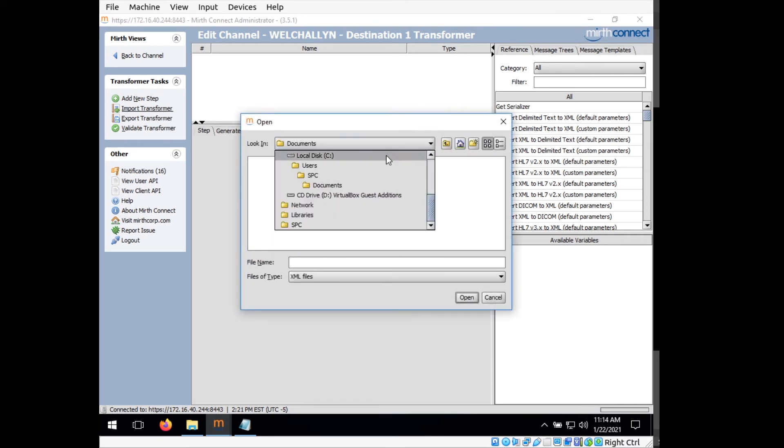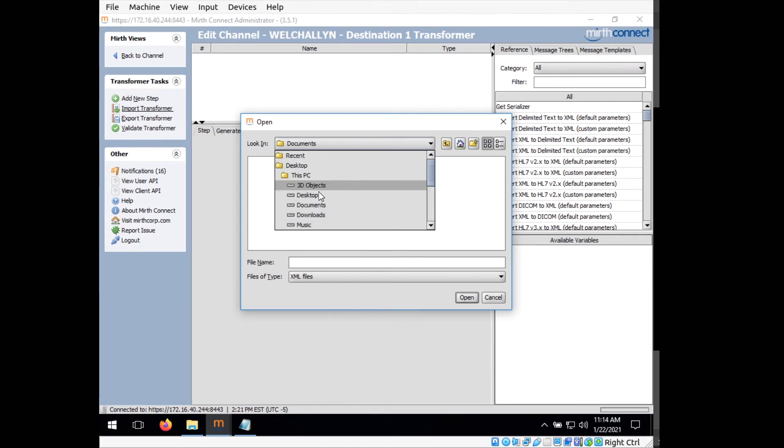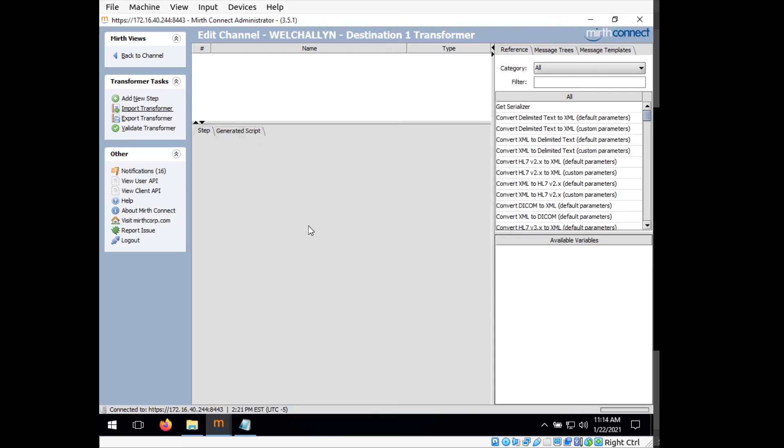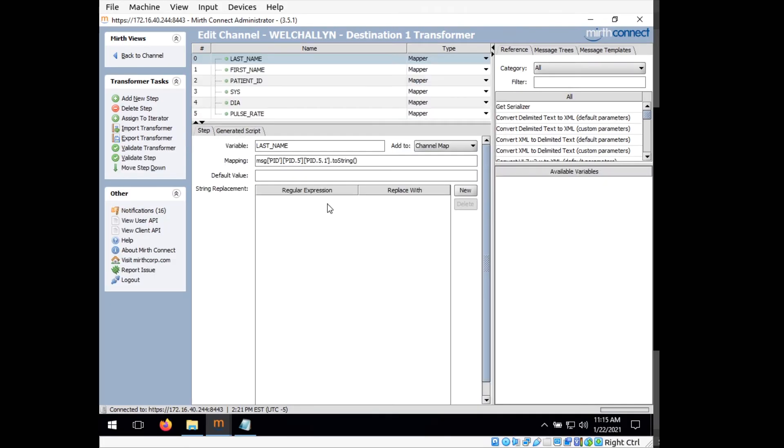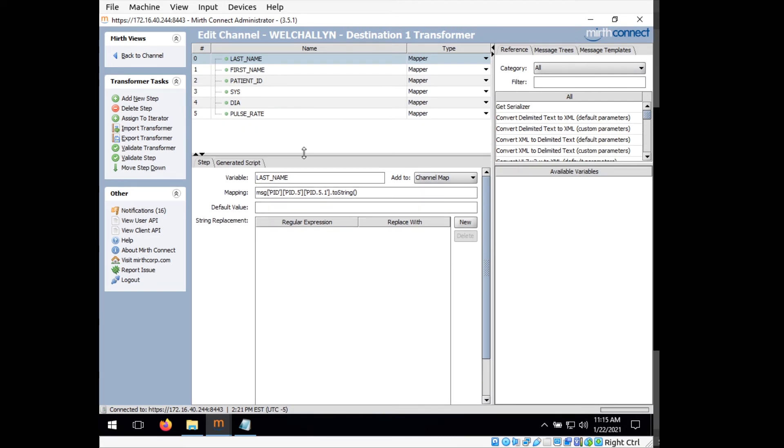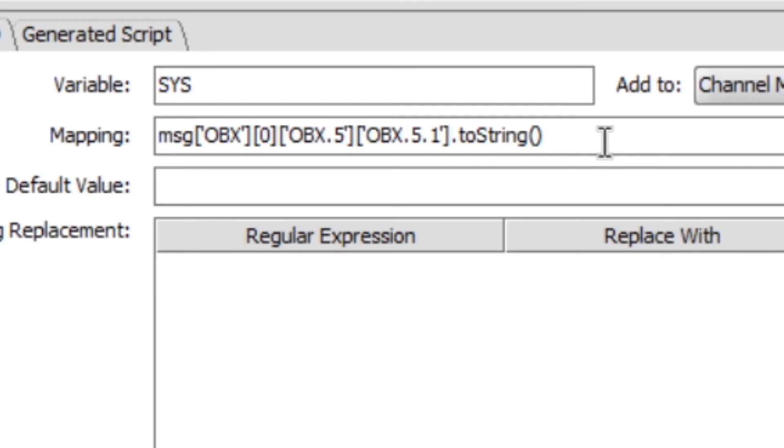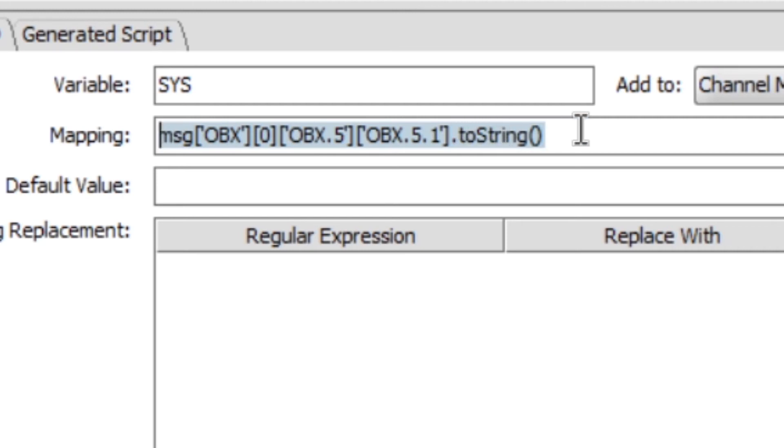And it will be in the pack that you downloaded. And open up the transformer.xml file. And this will automatically fill out the data that we need to store. And you can see here in the mapping, this is what it's looking for, these individual pieces of the XML data, and it's going to extract those and save them for later so we can use that in our database.